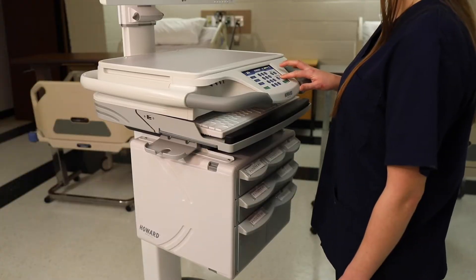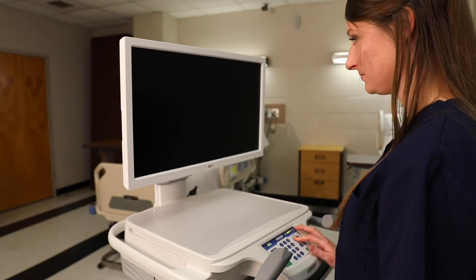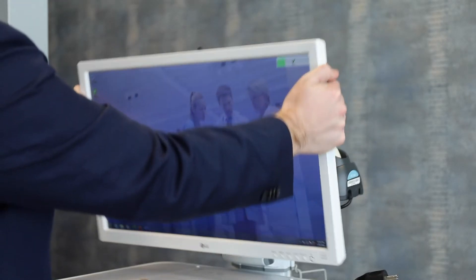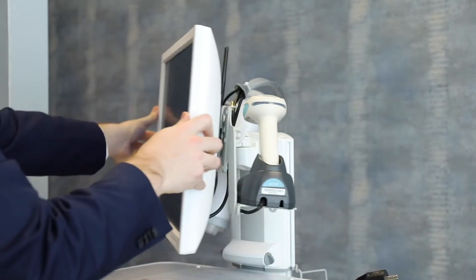Adjust the work surface height by pressing the work surface up and down buttons located on the right side of the keypad. You may also adjust the height of the monitor by pressing the monitor up and down buttons. The monitor mount allows for a wide range of motion, panning left and right for off-axis viewing and tilting up and down for the most natural viewing angle.